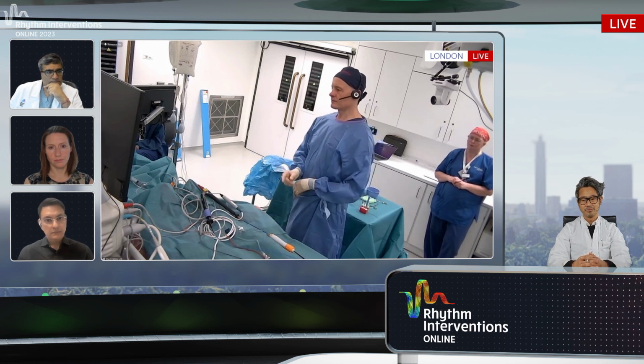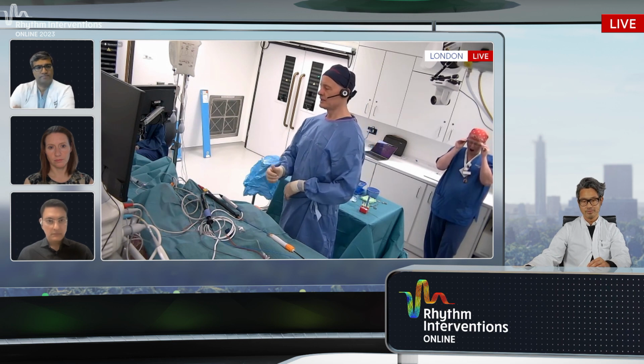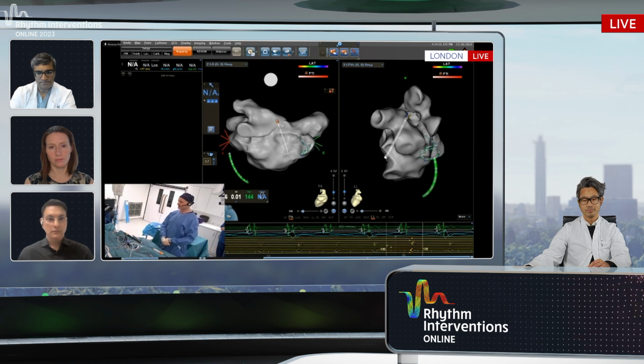Yeah, so my logic is I'm always going to check the veins and re-isolate them. So I start in the left and then go back to the right, because it's just easier for the workflow, because once I've done my puncture, Sachin will take the TOE probe out, and the patient's then left without a probe down.